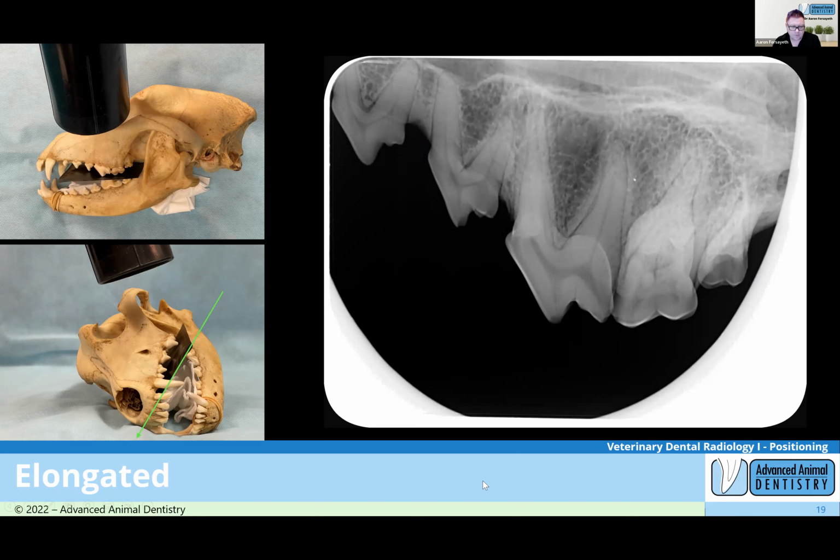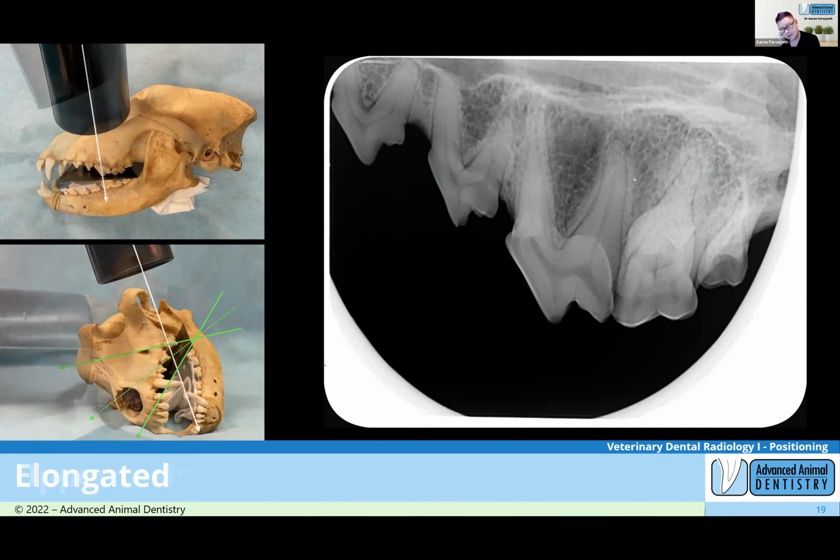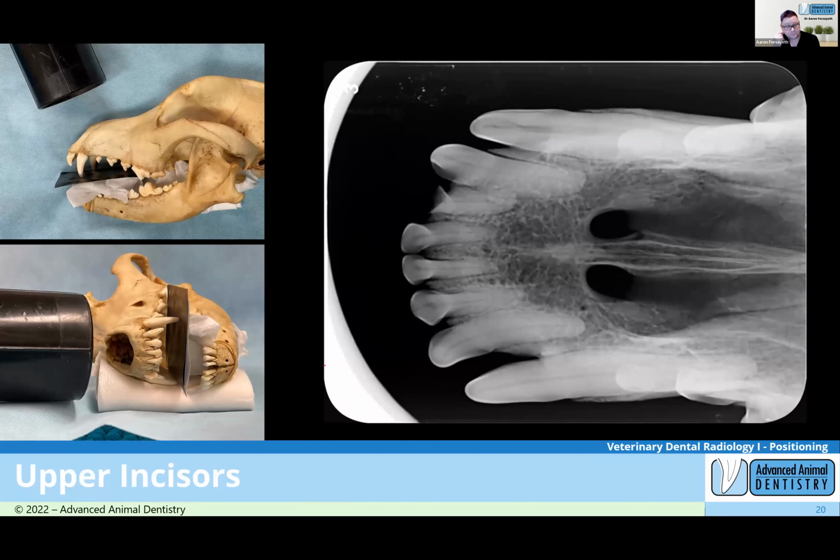On this one, we're going to make a bisecting angle, same as the last three shots, but this time we're going to throw it all to the wind and not bother looking at the bisecting angle. We're going to shoot wherever we want, pretty close to on top of the tooth, sorry, perpendicular to the tooth. That's the image we get. You can see the angle between our plate and our beam is too acute. So a big, long, stretchy shadow in the afternoon. I didn't do what Beck asked me to do this afternoon.